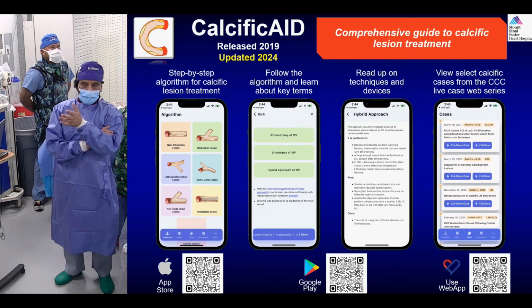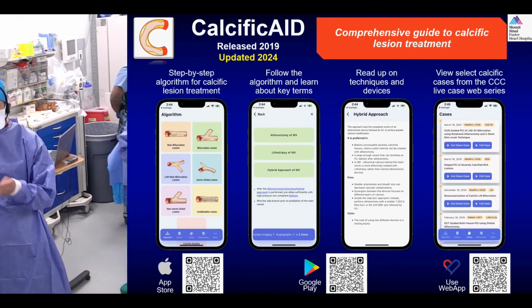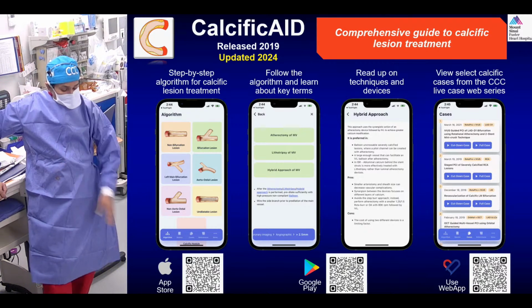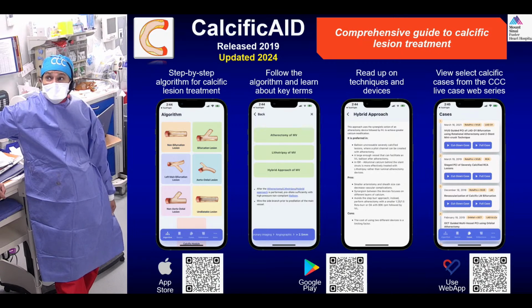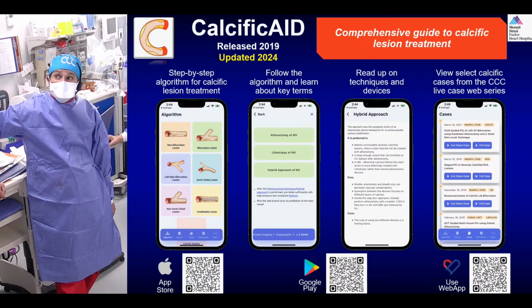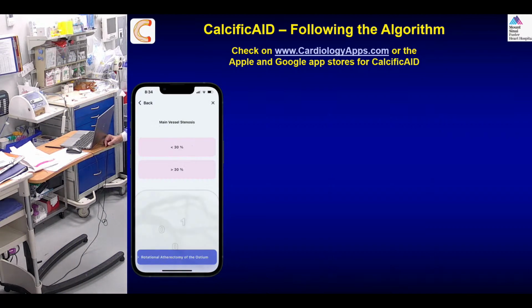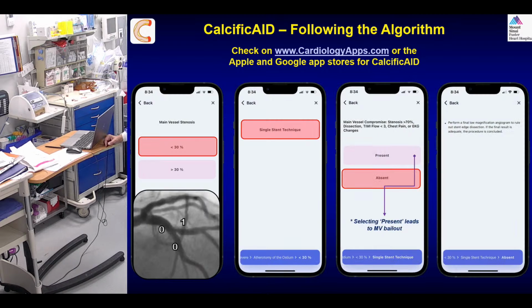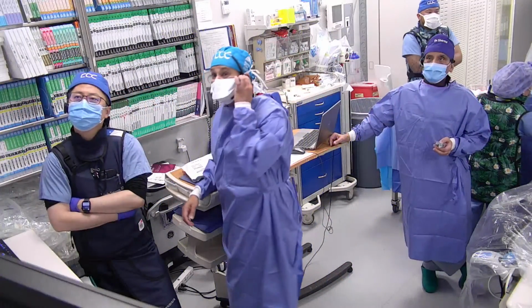Okay. No, so Dr. Kini wanted to say something, and then we'll go to a presentation. Yeah. No, this was just a CalcificAID. I wanted to see how we would have done this case with the app. This is the updated CalcificAID which we released recently, where we go through how we can do device synergy. Okay, perfect. So let's go to our CalcificAID algorithm. So you had to tell them. This is our case? No. Oh. Yeah, we did the last one. Okay. Was a very good one. Okay. Let's go to our presentation.